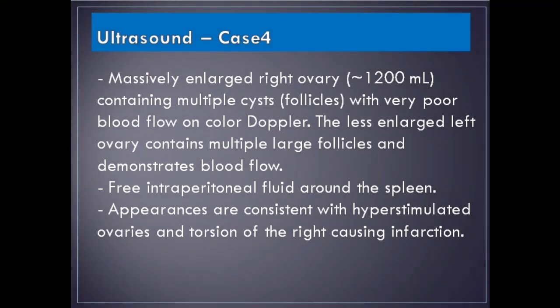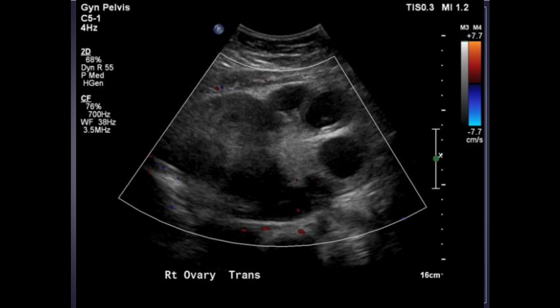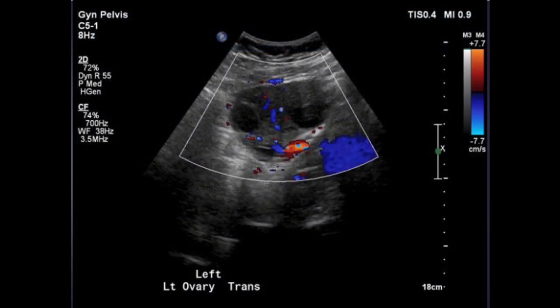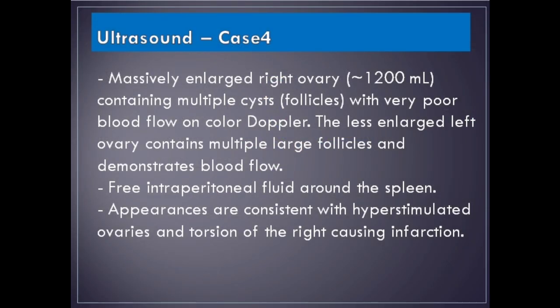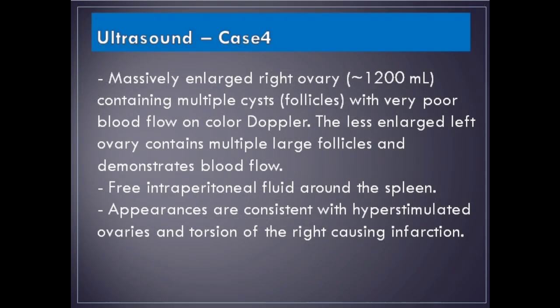Case 4: A 30-year-old female presented with severe right abdominal pain following ovarian stimulation for infertility. Ultrasound imaging findings show a massively enlarged right ovary totaling 1,200 milliliters, containing multiple cysts and follicles with very poor blood flow on color Doppler. The less enlarged left ovary contains multiple large follicles and demonstrates blood flow. Free intraperitoneal fluid is seen around the spleen. Appearances are consistent with hyperstimulated ovaries and torsion of the right ovary causing infarction.